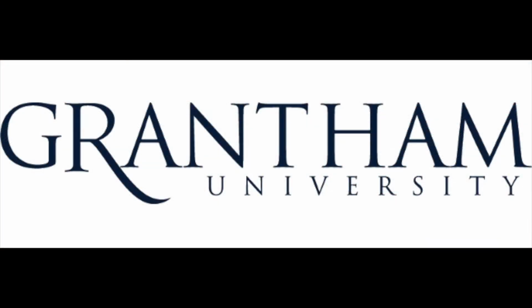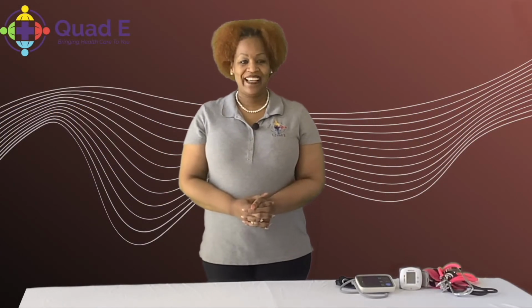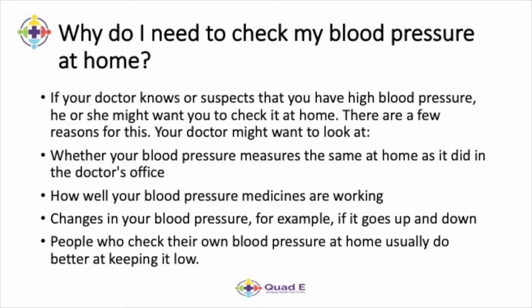All right, so one of the questions we want to answer is, why do I need to check my blood pressure at home? If your doctor or caregiver suspects that you may have high blood pressure or hypertension, they would like for you to monitor your blood pressure at home. There are a few reasons that we want to do this, okay?